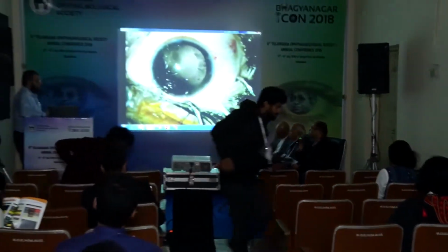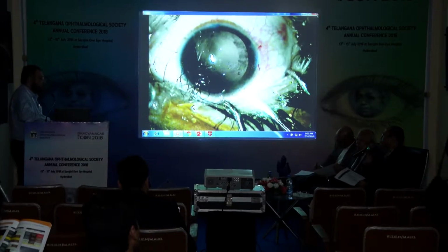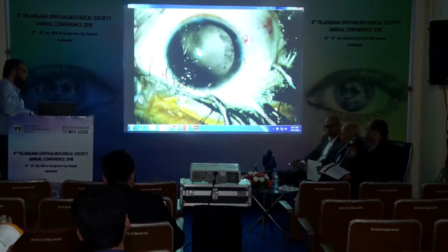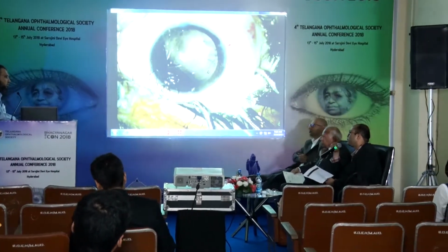Yes, so being a child and with the intumescent nature of the cataract, did you notice there are some clefts within the nucleus and the substance of the lens? No, it was not a child, he was a teenager, 19, 20 kind of guy. Yes, it's a pediatric sort of thing. Usually the real difficulty comes in intumescent cataracts where those clefts are already formed. That indicates a high intralenticular pressure.